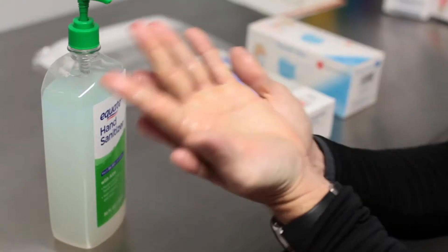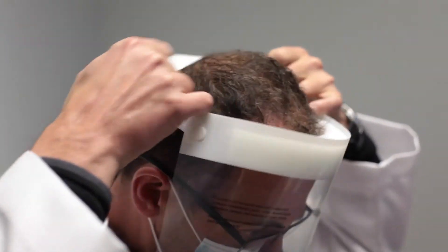In order to take a collection, you must first properly sanitize your hands, put on gloves, a mask, a face shield, and lab coat.